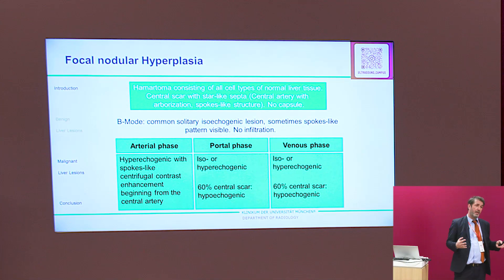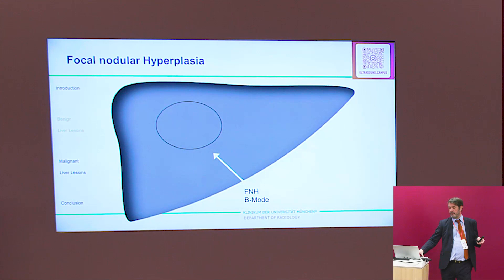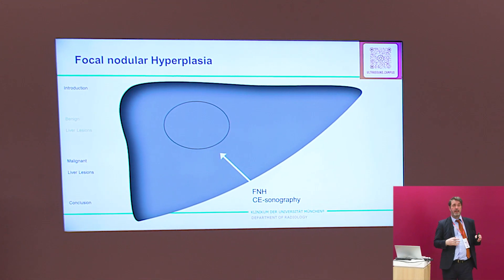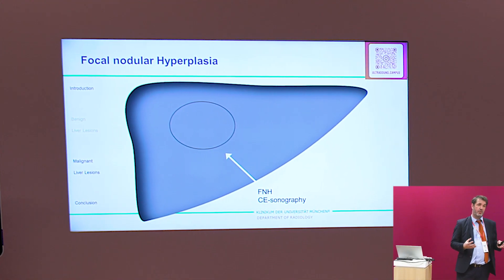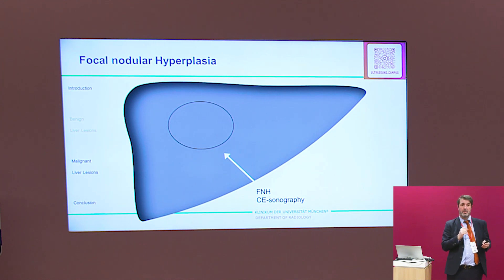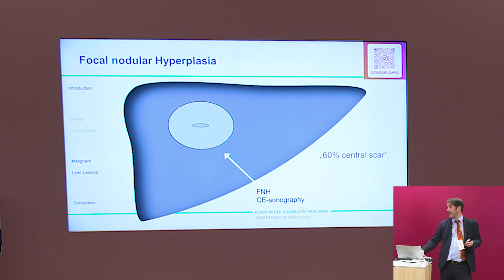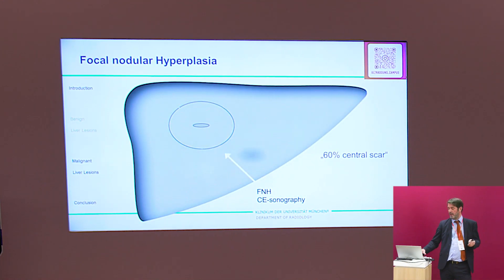FNH behaves a little differently. They have a strong uptake in the arterial phase and remain hyperenhancing in the portal venous and late phase — no washout. Sometimes FNH can be a challenge to find in grayscale because they often have the same echogenicity as surrounding tissue, so there is a good chance of missing them. When contrast is injected, you see filling from the center to the periphery, very strong — much stronger than the surrounding tissue.